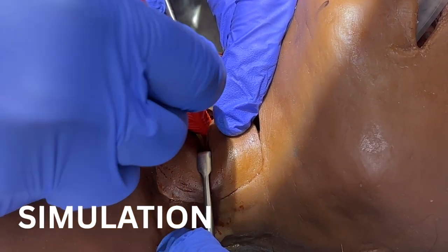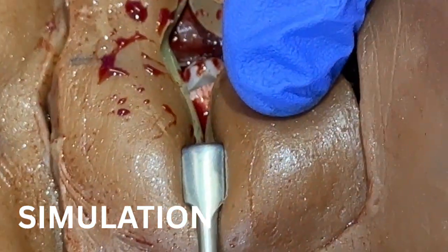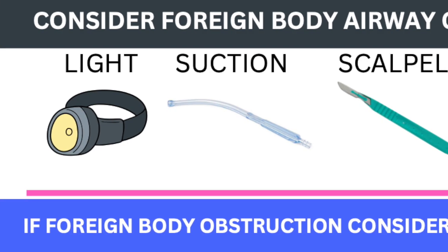You have to look for and identify tracheal rings. When you see the rings, you can cut through that structure — so that's really tricky. Now you guys have in your kit a headlamp so that you have the ability to have good lighting wherever you're working.